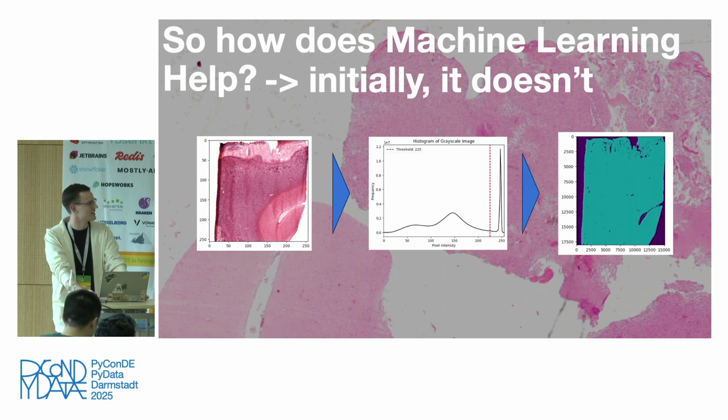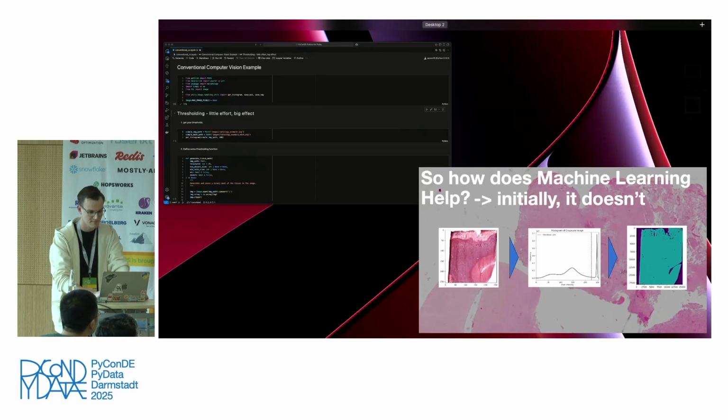And then we can just apply a thresholding map, and we can, in general, reduce the area we have to analyze with machine learning by at least 1/3 of the whole image. So without using any machine learning, we already solved 1/3 of our task.